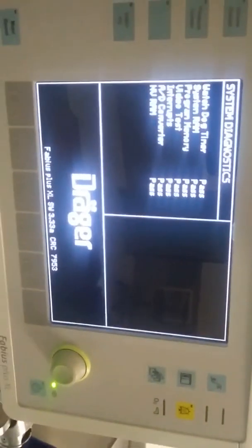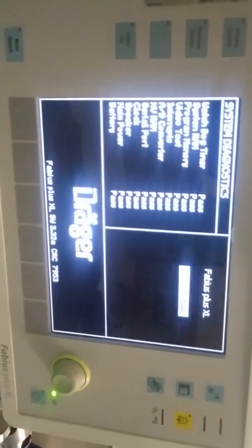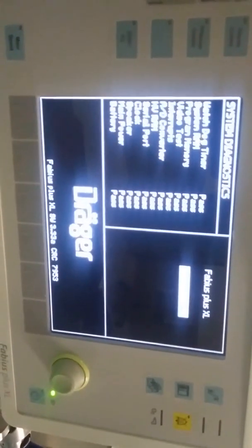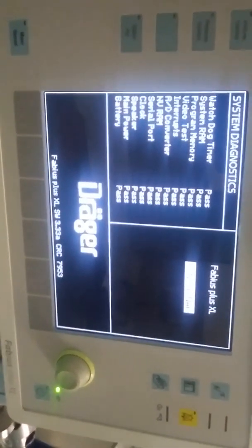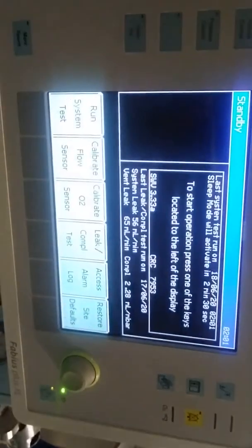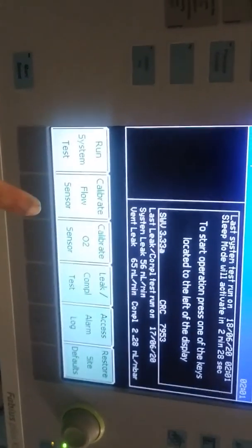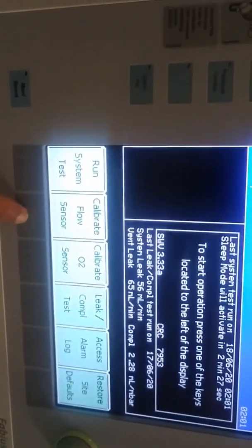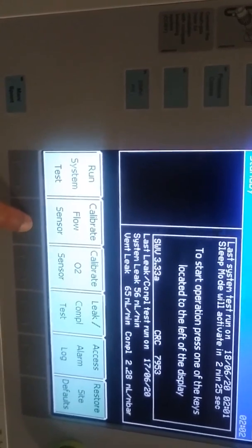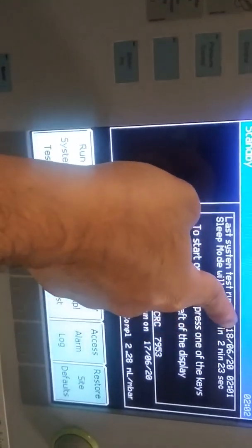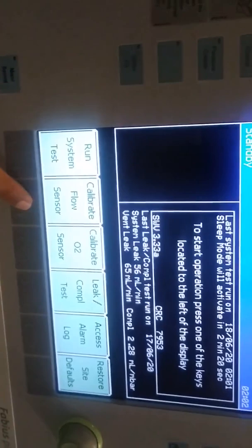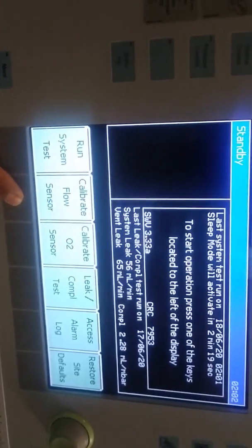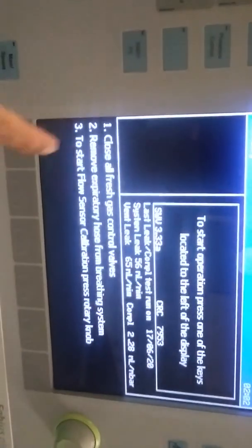First step is run system test. Click the below option and see all automatic checks going on. Display shows all checklists like system software, clock, timer, speaker, alarm, date, main power, battery, etc. If anything happens wrong we can see the monitor with indications.